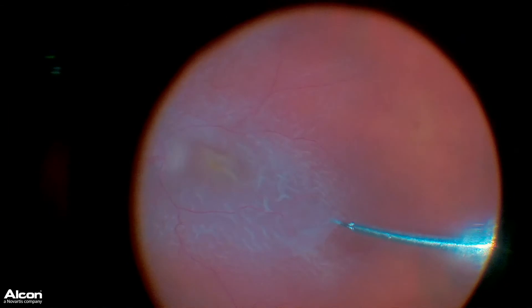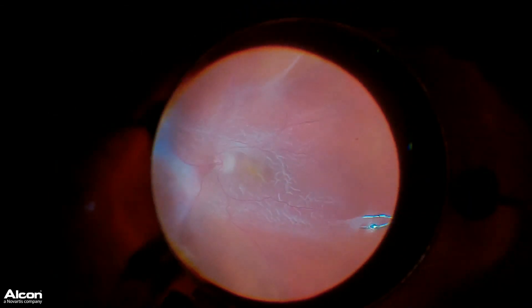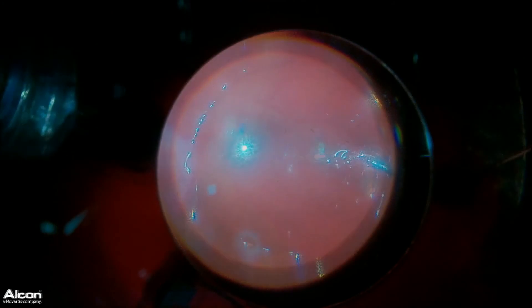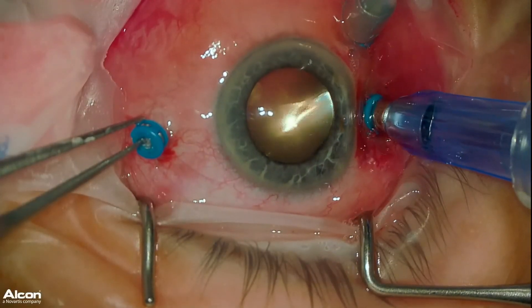Once we get a sufficient amount of this somewhat immature scar tissue off, we're actually able to flatten out the retina under air and laser the retina flat, and then we put the patient under silicone oil for permanent tamponade.